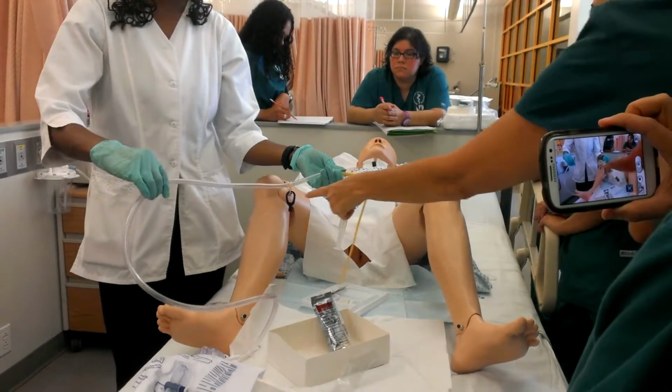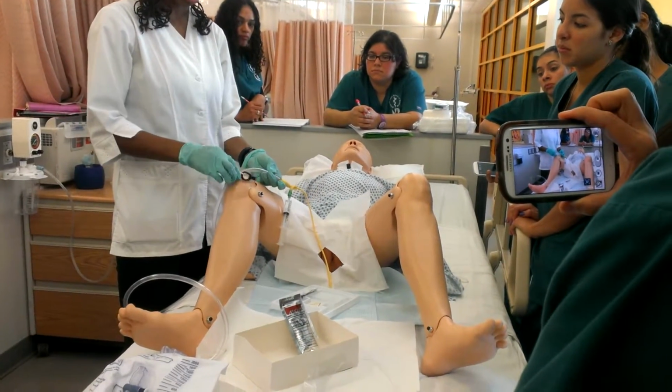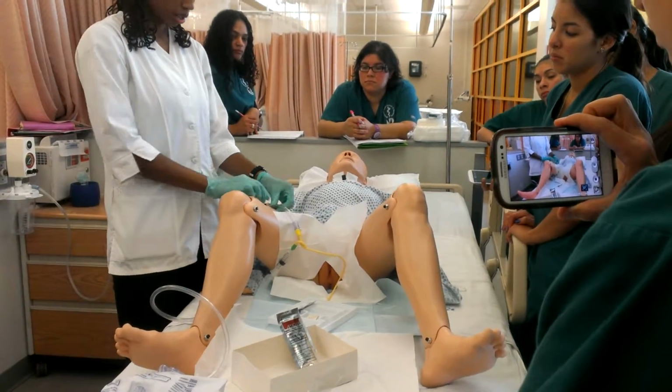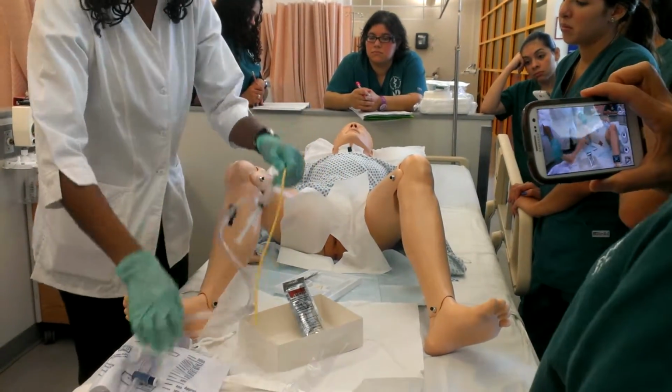What is this thing for? That is just if you want to clamp it to their bed, but we don't do that anymore. So this is an old one. Now they have a leg strap, and you just kind of secure it to their thigh. They used to plug it to their gown or do whatever, but we don't do that anymore. So that is for female.